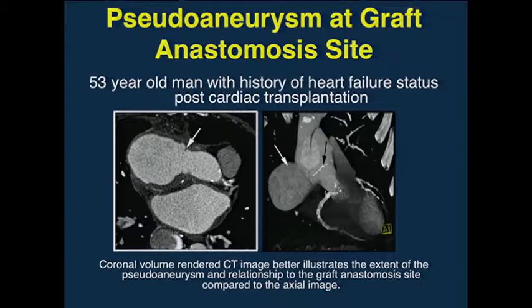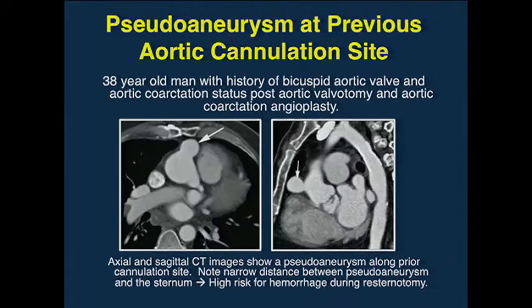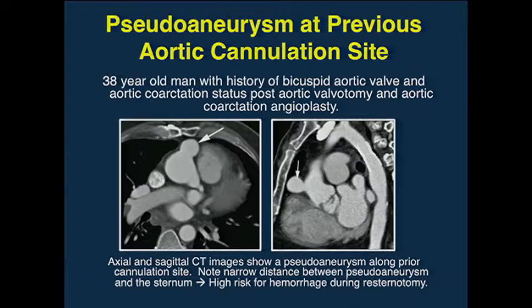Here's a nice case showing a pseudoaneurysm at the graft anastomosis site, very nicely seen from the axial into the 3D. Here's an example of a pseudoaneurysm at the coronary artery anastomosis site—these are usually smaller and the propensity to rupture may be a bit higher. And here's a nice example of a pseudoaneurysm at a previous cannulation site. Looking at the aneurysm and the site, you can put things together, and often the 3D mapping helps you understand the process.